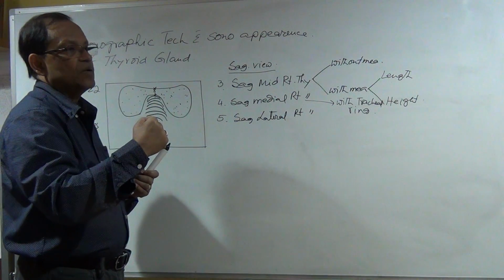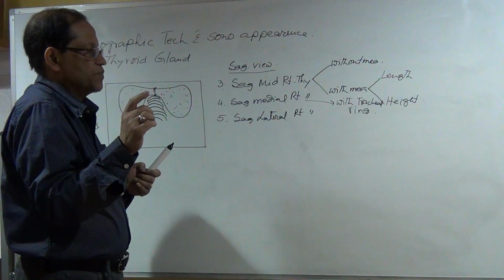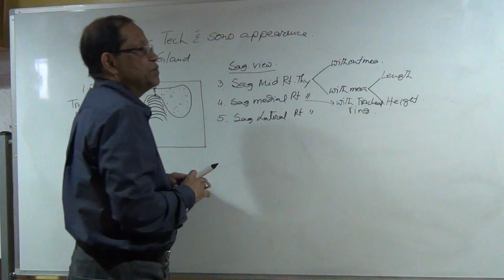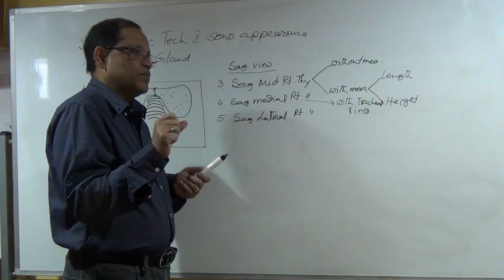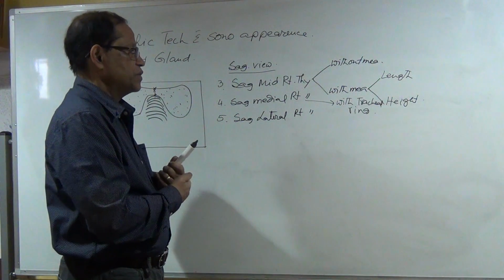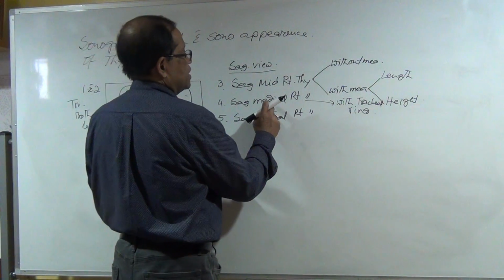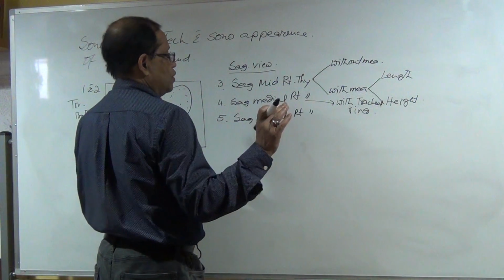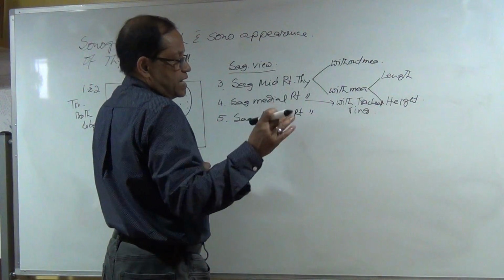Whatever the tissue you got, that is the medial portion of the thyroid gland. Sometimes you are getting the medial portion of the thyroid gland with the tracheal ring. It comes like that too. Not necessary that you have to take the tracheal ring along with the medial part. No, tracheal ring is your landmark. Once you got it, then come back.